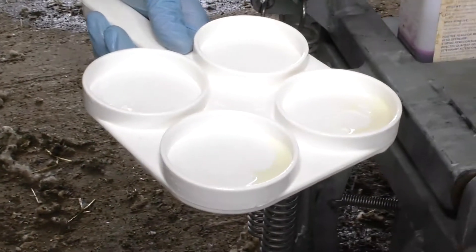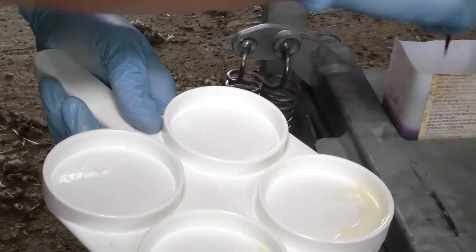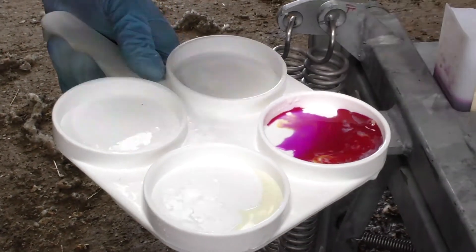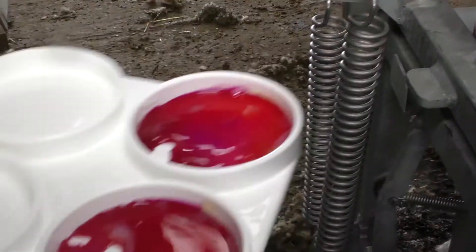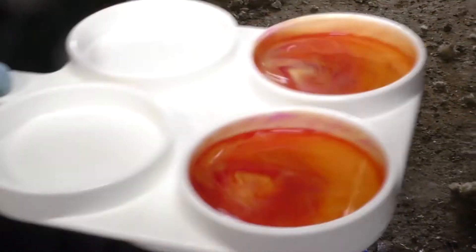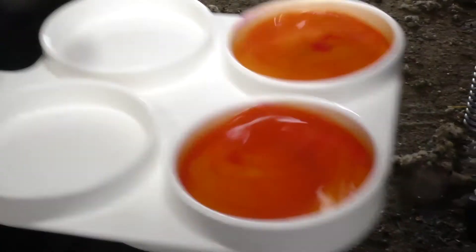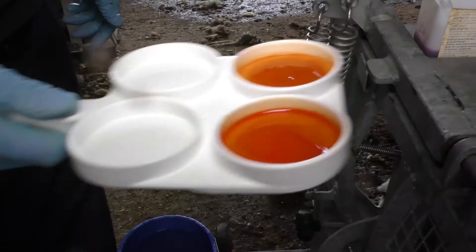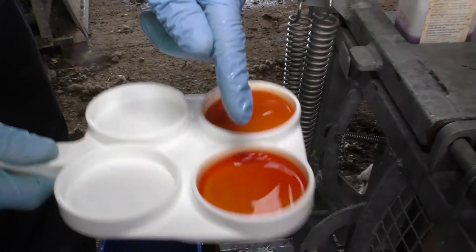We're now going to add three mils of CMT liquid into each well, and then begin mixing. As you start mixing around it's very important to start grading as soon as you can. And you can see immediately there that this one's going a lot thicker than that one.